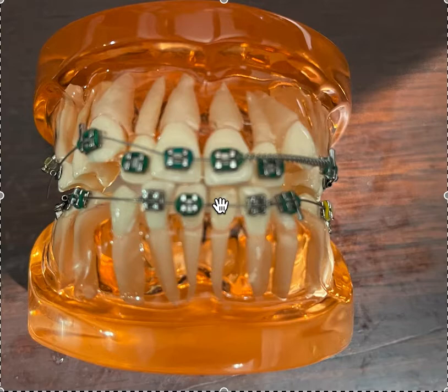If I'm hypothetically opening up a new shop and it's only me working there, that's the bracket I'm using. I'm using 018 Roth. That's just something that I like best. But it's also a little trickier to get those wires in, because it fills the slot sooner with a lighter wire, so it's a little more technique sensitive. So I don't recommend GPs use 018 Roth. I recommend they use 022 Roth or MBT.